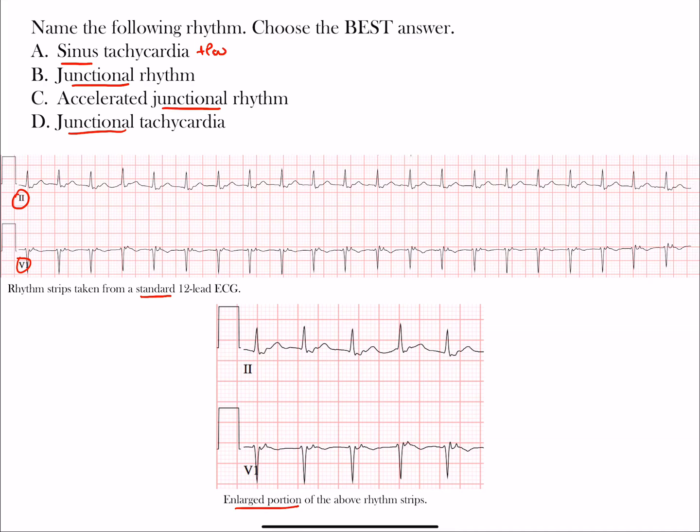With junctional rhythms, we will not see P waves unless they are coming at the end of the QRS complex or buried within it. If you look down here, we do not see P waves preceding our QRS complexes. There's no P wave coming before in these leads.